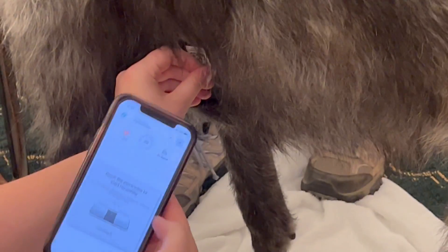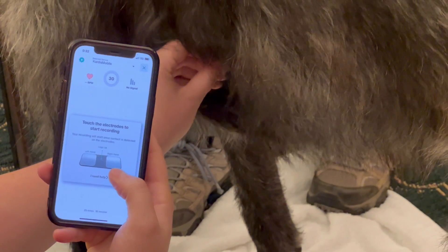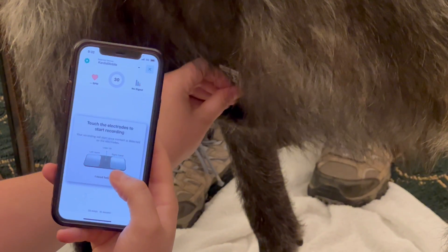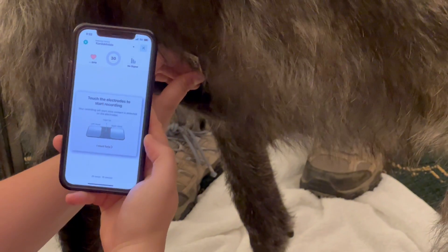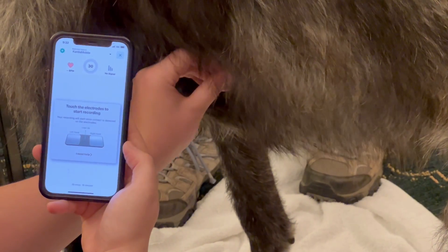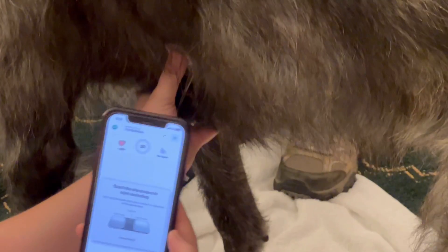I'm going to tap 'Record my ECG' — this is the important step. It's going to show the electrodes, and you want those to light up nice and blue. When they light up blue, it tells you that you have good contact. The closer your phone is to the dog, the better the signal, and the better the contact, the blue squares will come up.